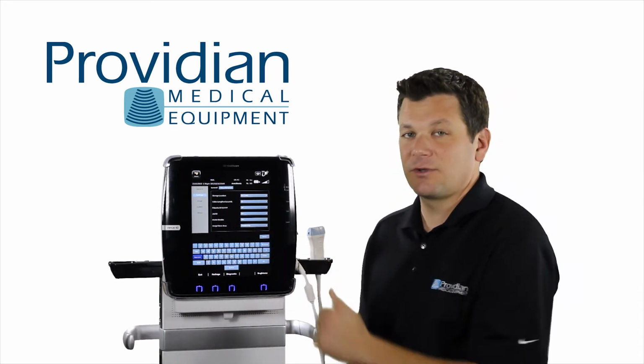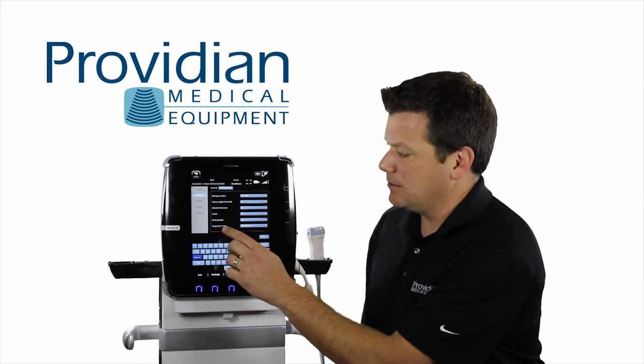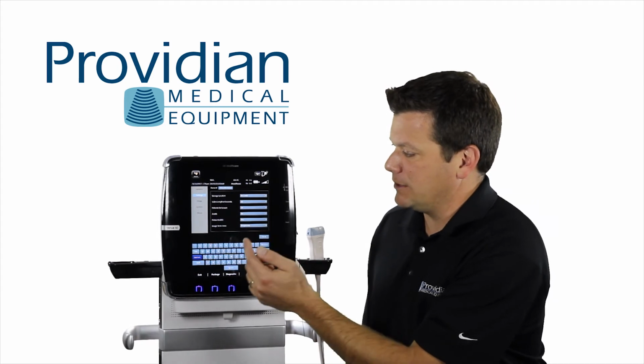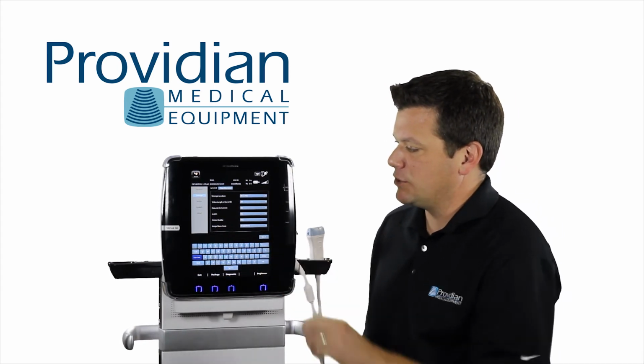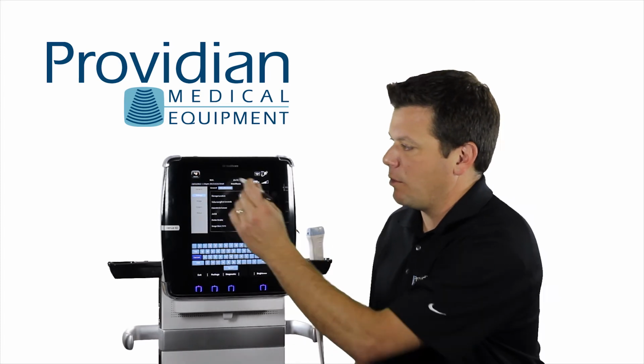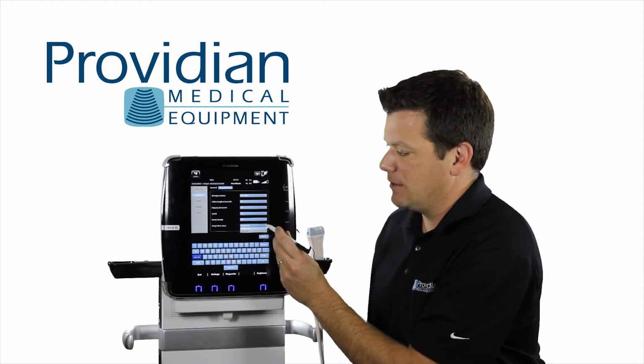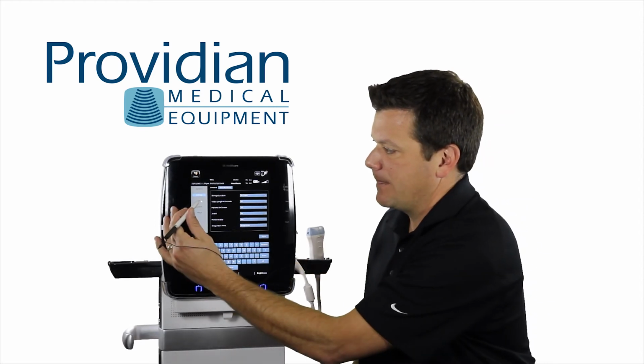Number of patients on screen when you go to the archive utility. You want a second patient ID. Do you want to enable the printer for the print storage? And what image storage would you like to save? If I chose just the image area, or do I want the full screen with all of the patient information on it? The default is set to the image area.